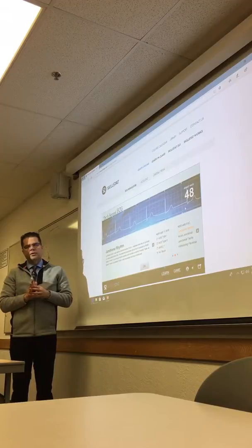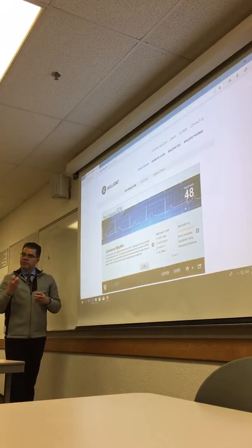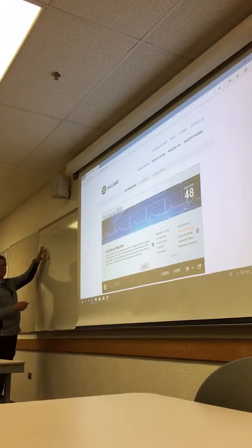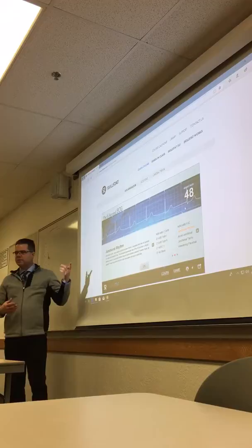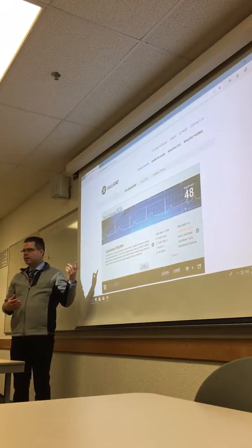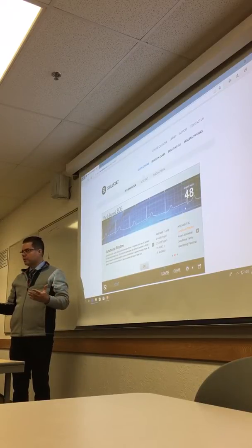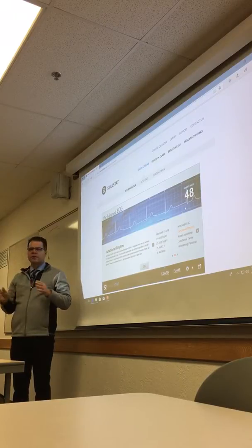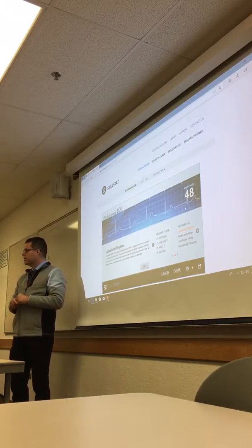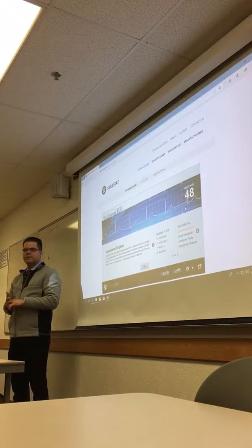So no P wave. So you guys know that if someone has a heart attack and that tissue damage happens somewhere around these nerve tracts, that's one of the most common causes, okay? So it could be from an injury, it could be from an infection, it could be from birth, there could be a lot of reasons for it, okay? But most commonly, when people start seeing this stuff, they start digging and looking and saying, oh, they've had previous heart problems before, so this is where some of these things exist from.